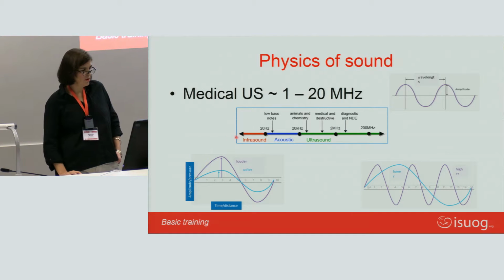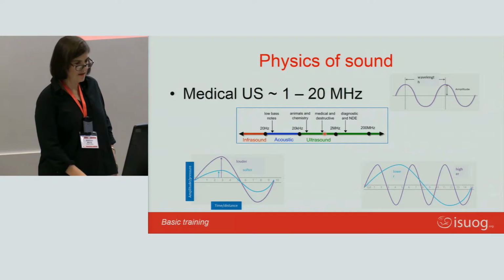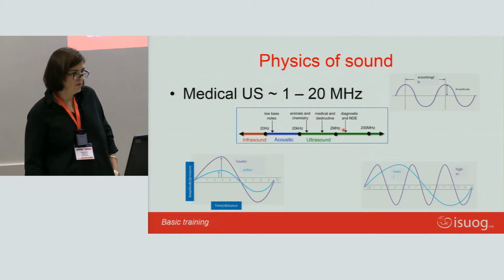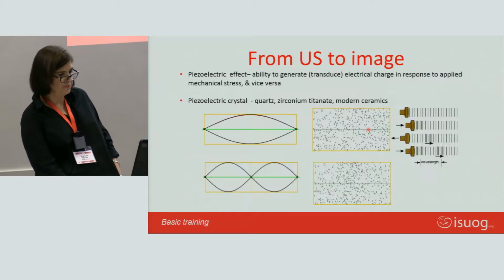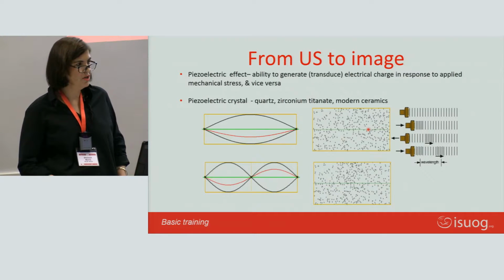And on this graph here, you can see quite a broad spectrum of sound, where the lower frequencies of medical sound are used in the treatment of things like kidney stones. And we scan at about 2 to 20 megahertz.